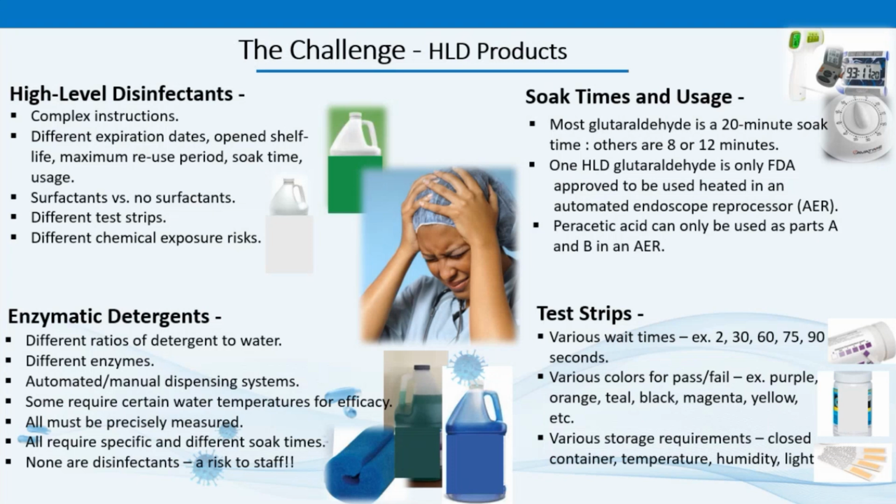IFUs state that the MEC test strip should be immersed in the HLD for a specified time, and the color changes interpreted after a certain amount of time. So you'd better not walk away from that test strip during the wait time because you might miss that color change. Now, the instructions for using and testing high-level disinfectant products are complex and challenging. No wonder there are challenges, and human factors contribute to widespread non-adherence with guidelines.